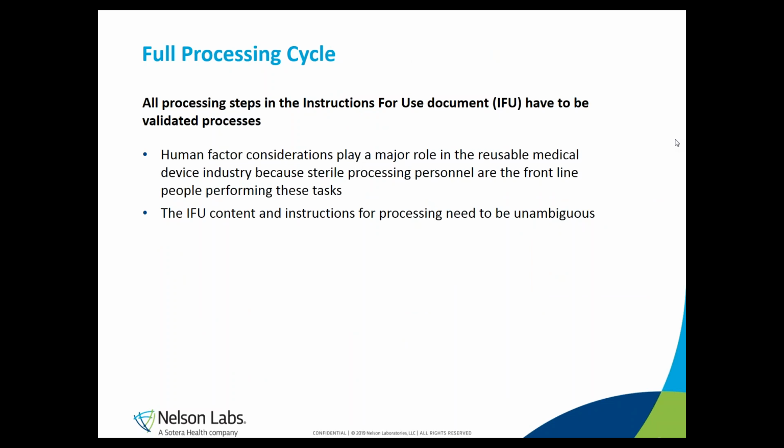Every step of the diagram is pre-validated. It is really important that validated procedures are clearly translated to an instruction for use document to avoid any deviations when applied in healthcare facilities, because deviations from this may impact the safety of the device and eventually may compromise the safety of the patient, and this is what we do not want.